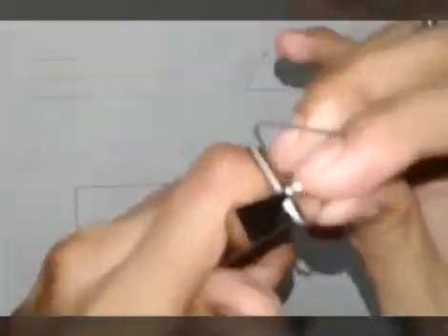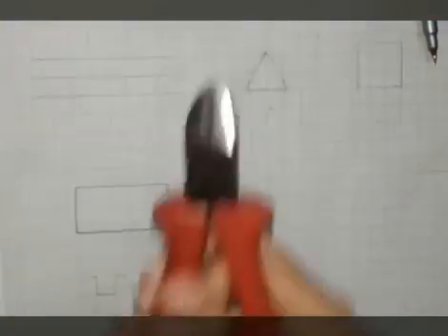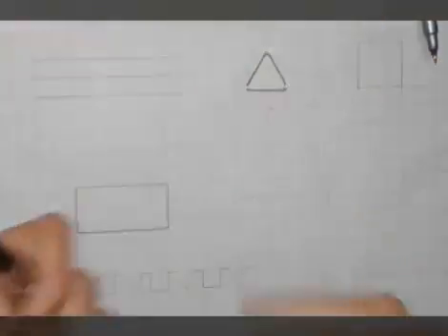We want to cut the extra wire after making the triangle with the cutter. Here we can go to the final triangle.